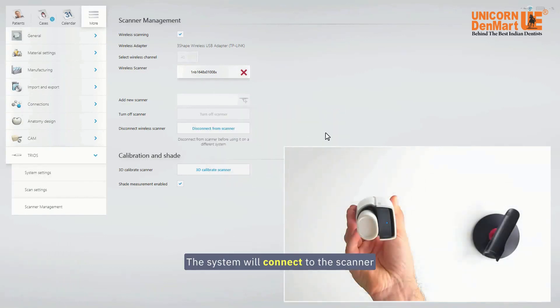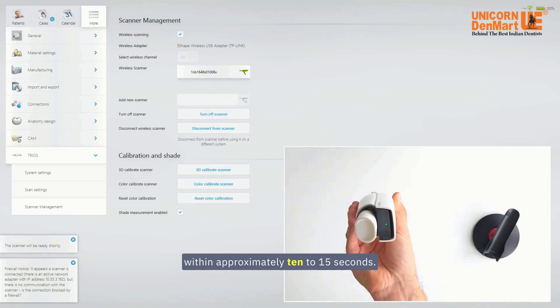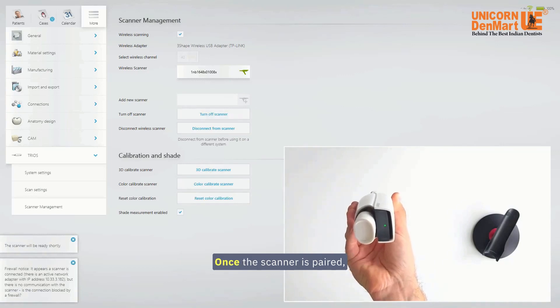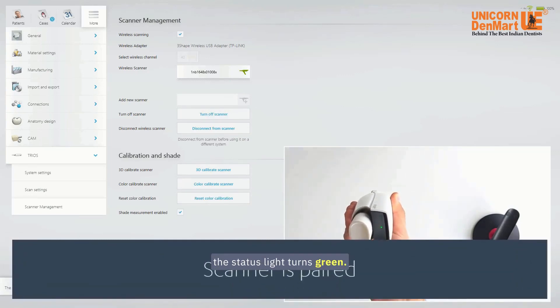The system will connect to the scanner within approximately 10 to 15 seconds. Once the scanner is paired, the status light turns green.